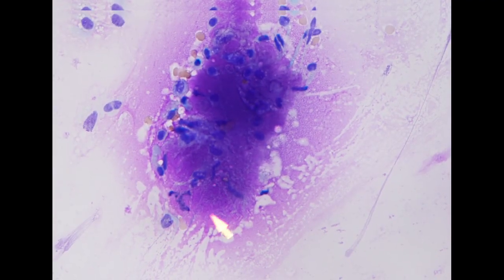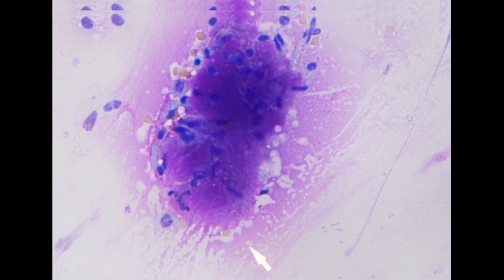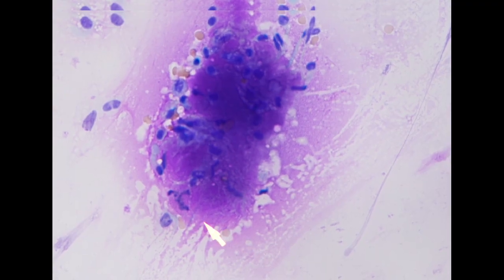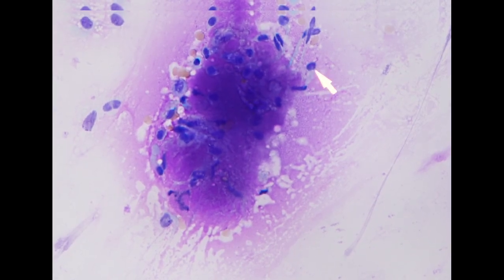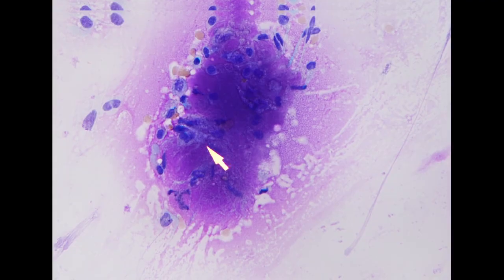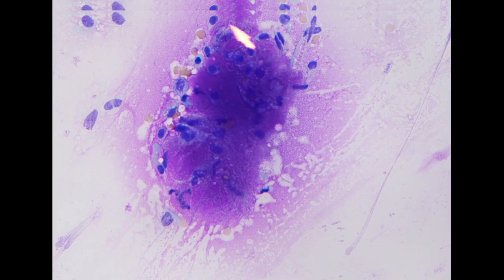There are a lot of different matrix-producing tumors in the salivary gland, but the diagnostic feature for benign pleomorphic adenoma is that the matrix material border is very indistinct and fibrillary. Additionally, you will see a very tight relationship of myoepithelial cells embedded in this matrix material.